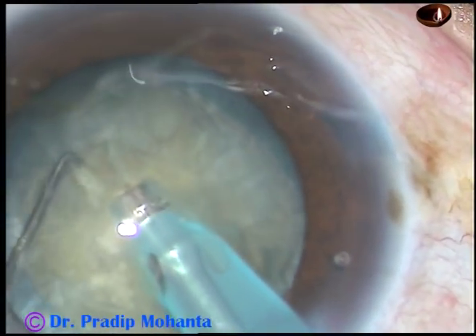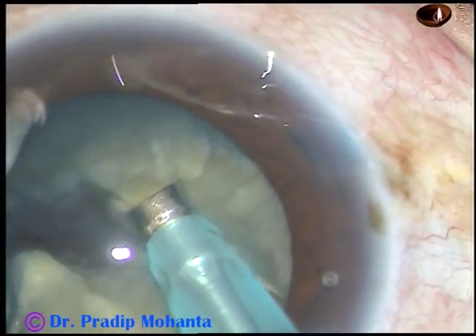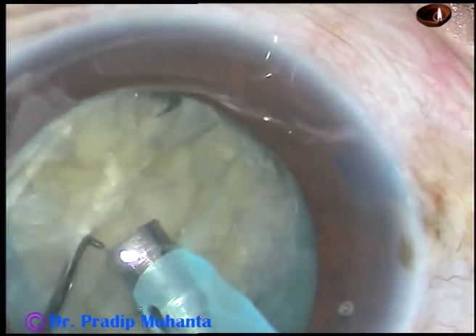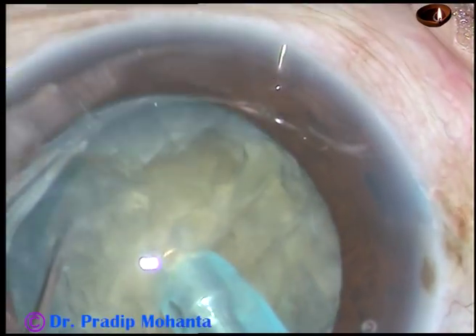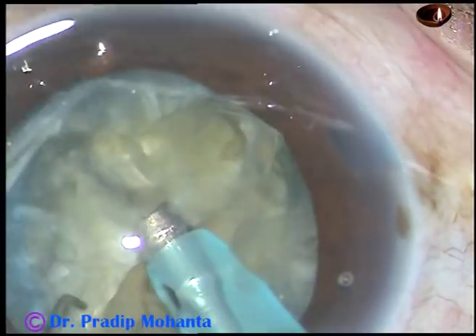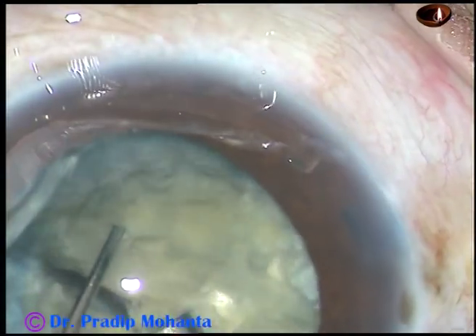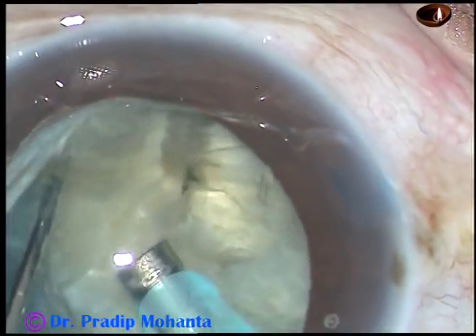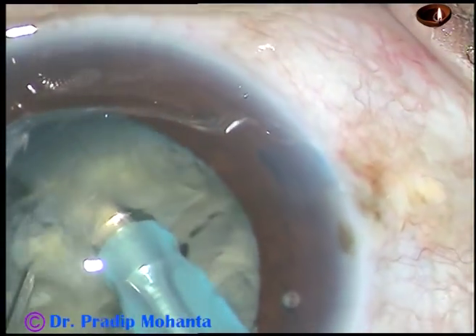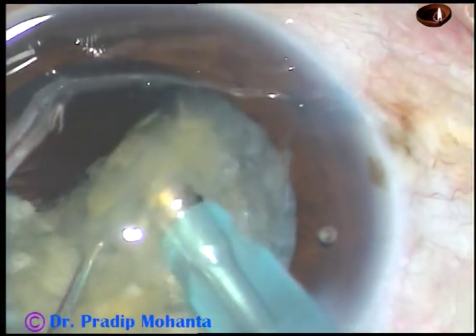And now this is submarine chop. Go through the substance of the nucleus near the opposite equator and chop it. Again, go through the substance of the nucleus and chop it at another place. The nucleus has been divided into four fragments.